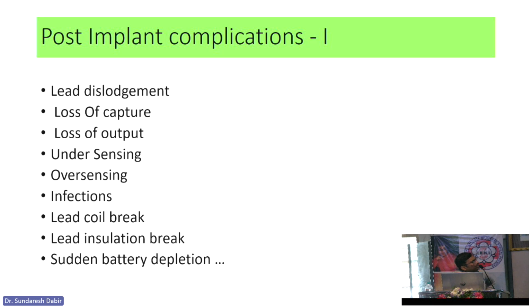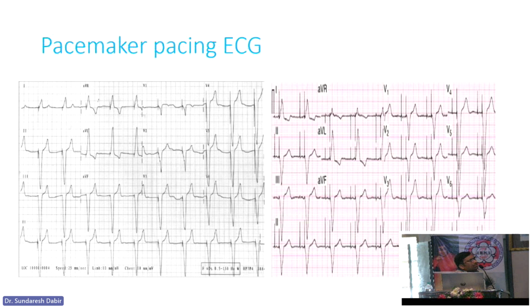And what you need to understand here is that sometimes in one chamber it will be sensed and in the other chamber it will be paced. So if it is CHB, I don't want to pace in the atrium. I'll be sensing only, right? The pacemaker will be sensing, and it will always pace in the ventricle, right?